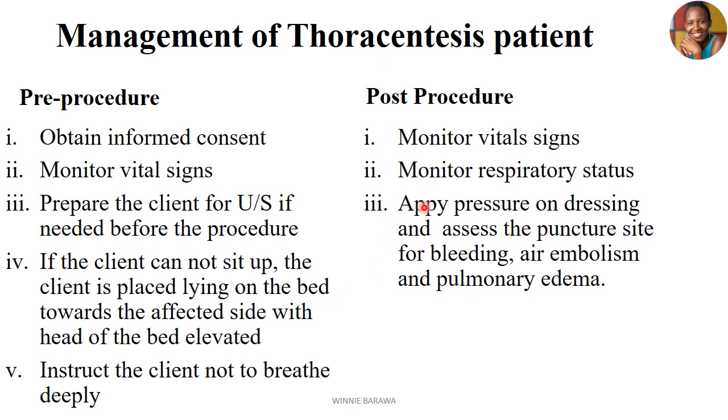And then the other bit is to apply pressure on the dressing and assess the puncture site for any bleeding, any risk of air embolism, and then check for any state of pulmonary edema. That is a state of swelling because of the insertion site, or could be edema because of tenderness and fluid accumulation. So check out for such.